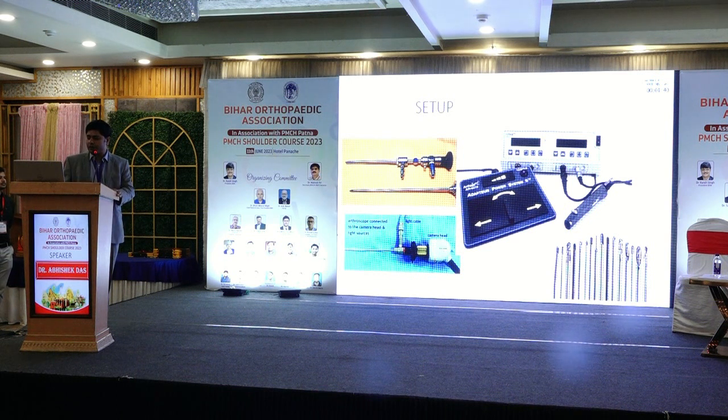And then the other important bit is lots of burrs and shavers. Now the problem I had last week was I had posted a case for rotator cuff repair, and when I asked, well, everything is ready, but then we didn't have the burr. The burr wasn't available in Patna. So this is another challenge. You need to think of everything. Now without a burr, how are you going to do your subacromial decompression? Sometimes things that can help you: my better half is an ENT surgeon, so I borrowed her microdebrider and then did the subacromial decompression with the shaver and the microdebrider, but that was a learning lesson for me. So I purchased a burr for myself so that I can use it. So every step you have to think.